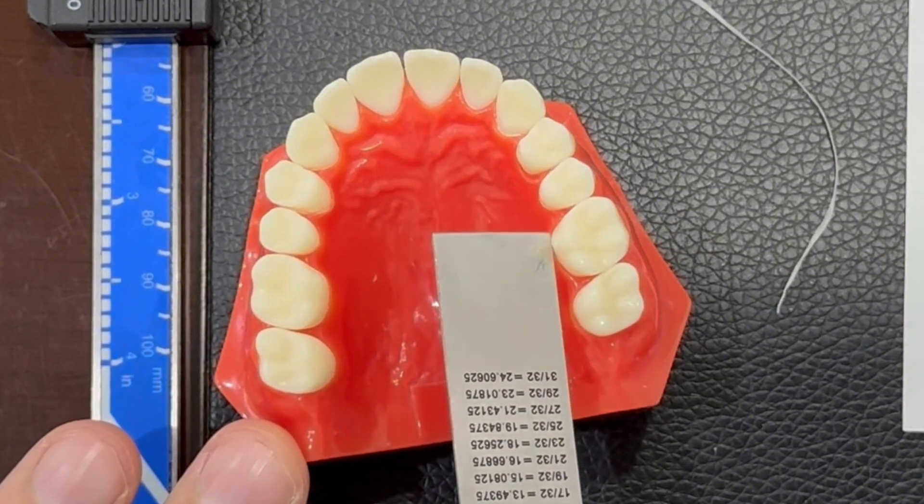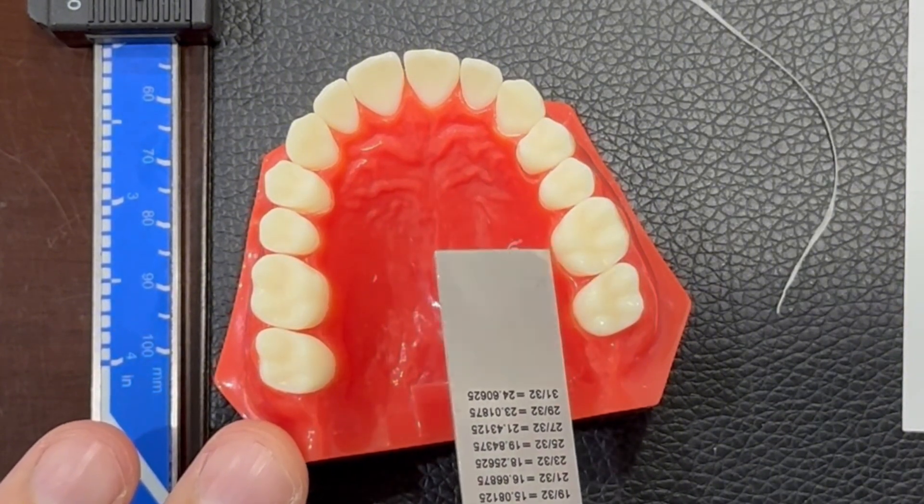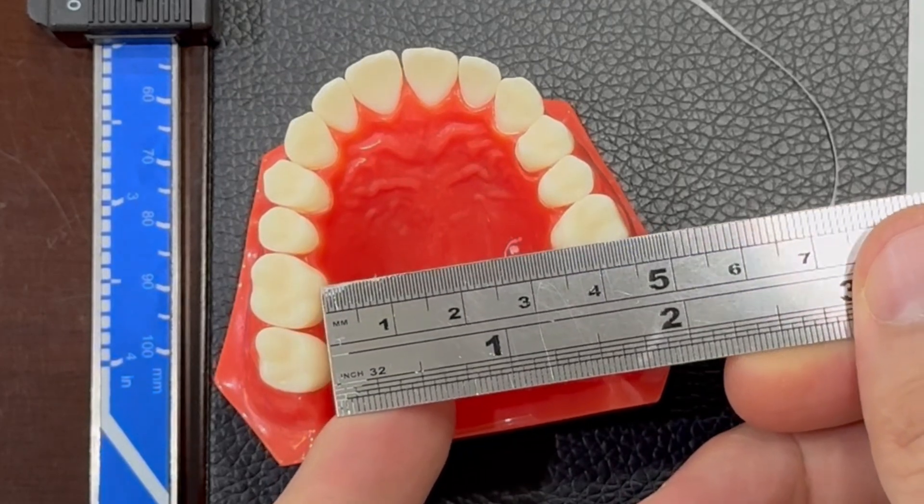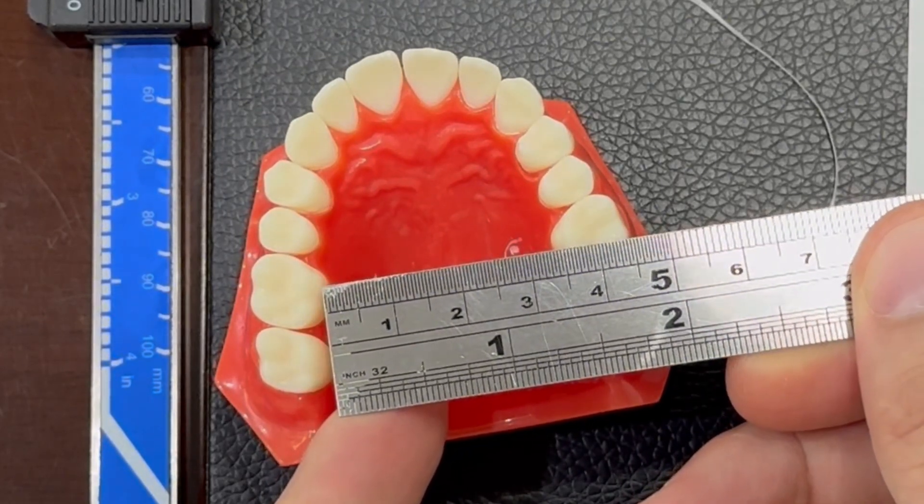We take the most prominent point — this one — and we measure. So for example here you can see it's almost 33.